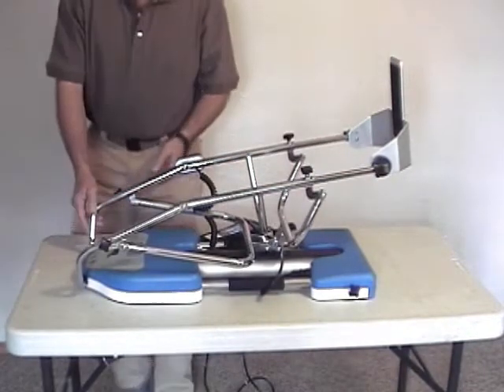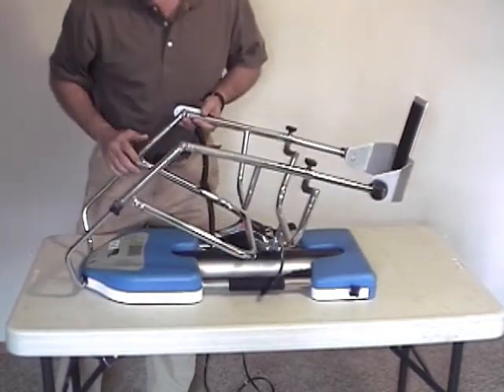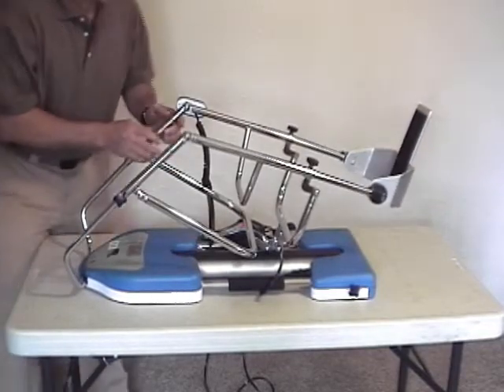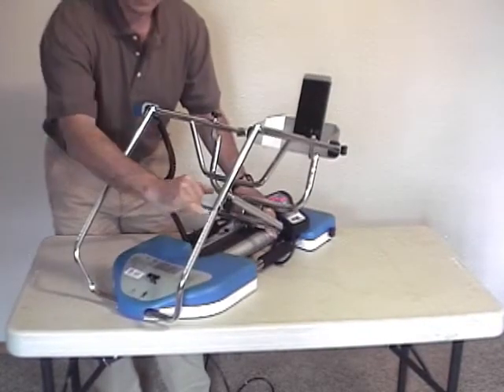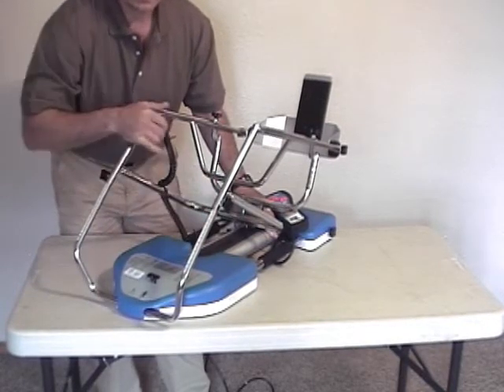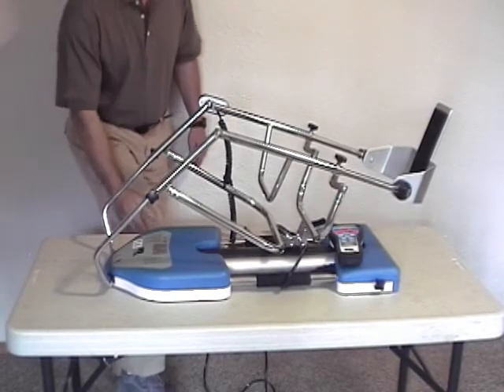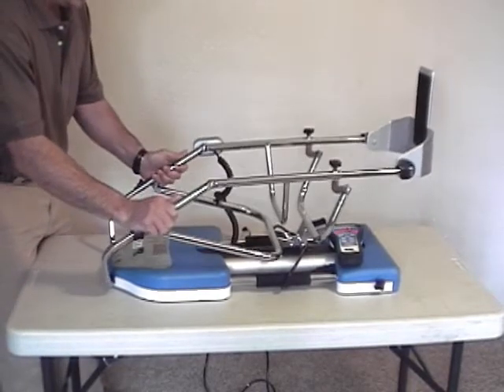At the other end of the CPM, you adjust the length for the upper leg — the femoral or thigh portion. You've got adjustment knobs on either side here as well, and that will give you your length adjustments. There are markings on each of the bars noting in inches and centimeters the length you're adjusting to. This correlates to the length measured from the greater trochanter — the hip bone — down to the joint space on the side of the knee joint.